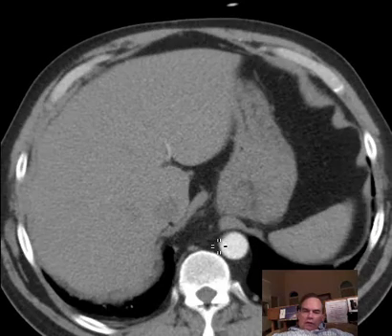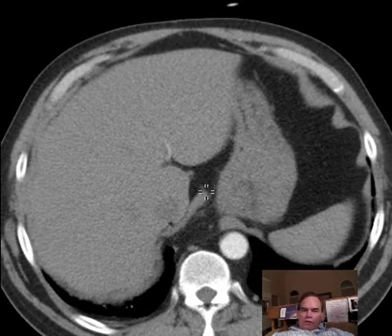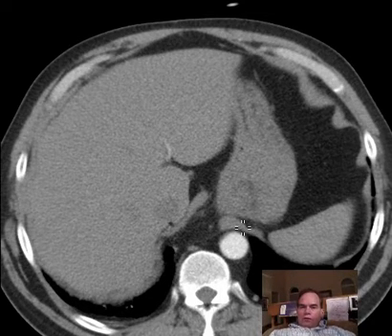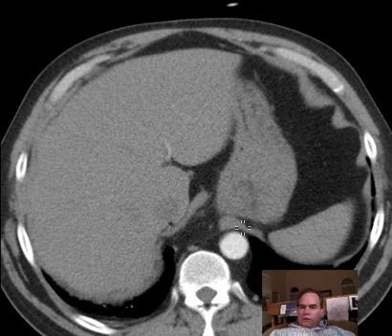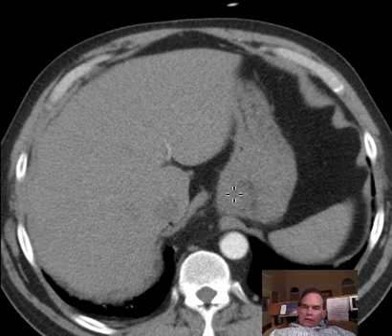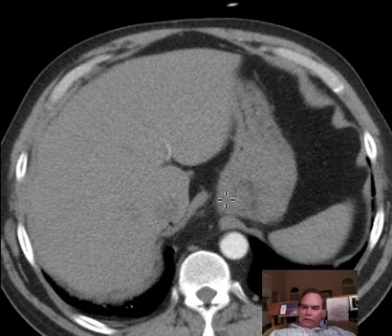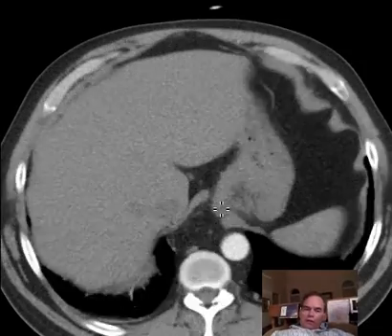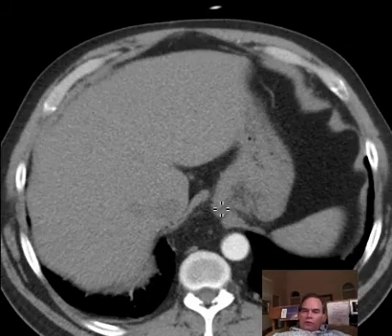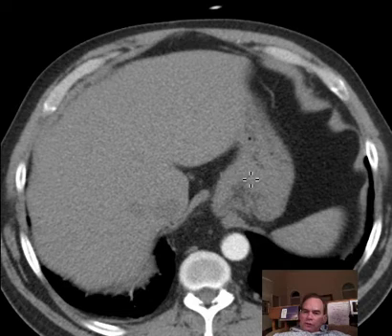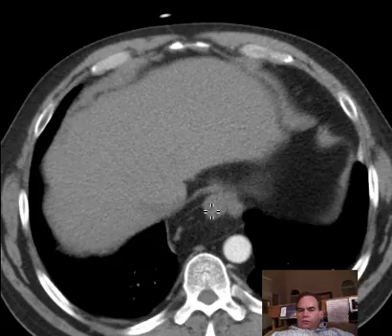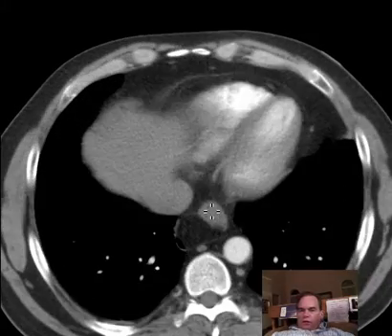Here we also have some interesting anatomy. You have the right crus and left crus of the diaphragm — C-R-U-R-A is the plural — and the distance between these crura is allowing some of the stomach to slide up through there. That's consistent with a hiatal hernia. It's not herniated at this moment, but the proximal stomach likely slides up and down between those crura and forms at least a small hiatal hernia from time to time.